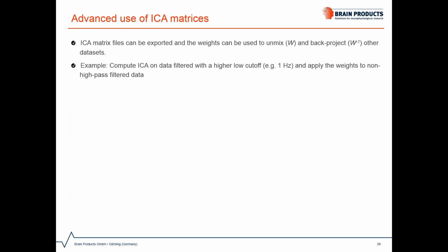Okay. Before going to the ocular artifacts, I already mentioned at the beginning, there's one very special pipeline you might be interested in. We receive sometimes customer requests where people ask explicitly about it because it's mentioned in a couple of papers. And I will in one slide very briefly go through that. So I talked about this when we talked about the filtering. And in this special use case, people want to compute ICA on data that is more strongly filtered than you would require for your actual analysis. However, people do that to get a cleaner decomposition.